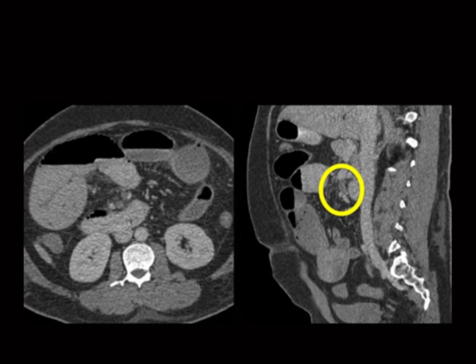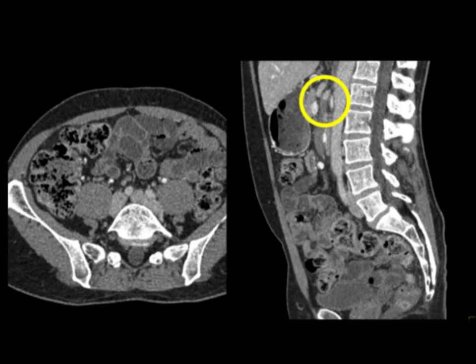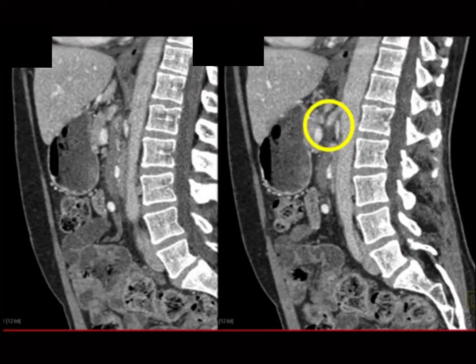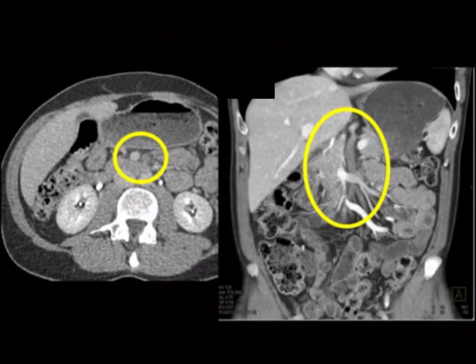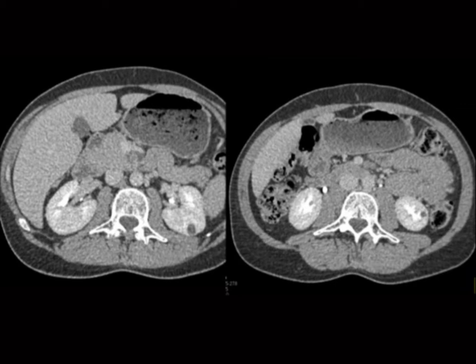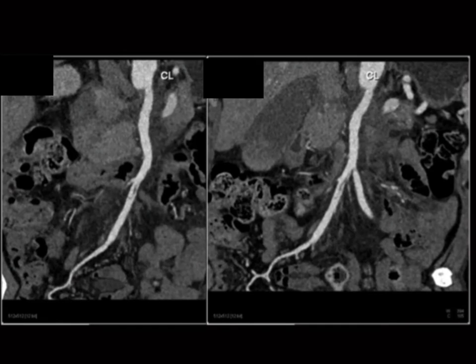It's very easy to overlook, like this case of abdominal pain. You look at the vessels quickly and everything looks pretty good — the bowel looks good, no inflammation, no stranding. But if you look carefully at the sagittal view, you see the SMA for a moment and then it's thrombosed. The entire SMA is thrombosed. The aorta looks great, the proximal SMA looks great, but the coronals show thrombus in the SMA and into the branch vessels. This patient had an acute thrombus that was treated, and a few days later the vessels were well-defined. Unless you look very carefully, it's so easy to miss.